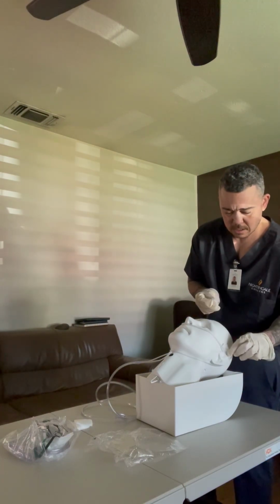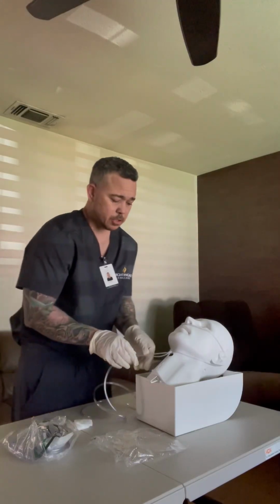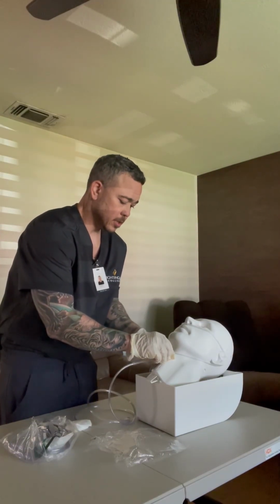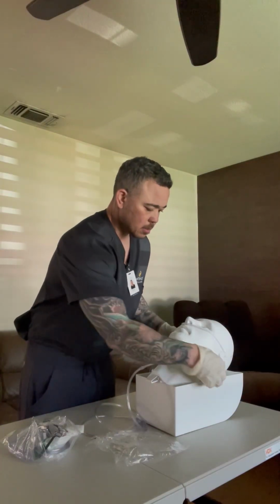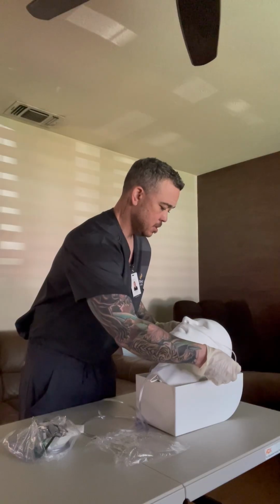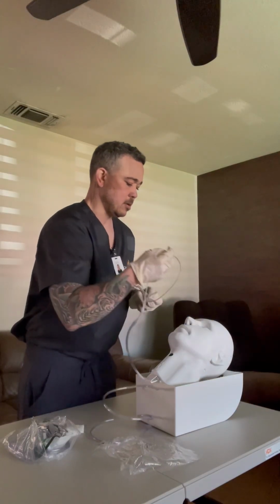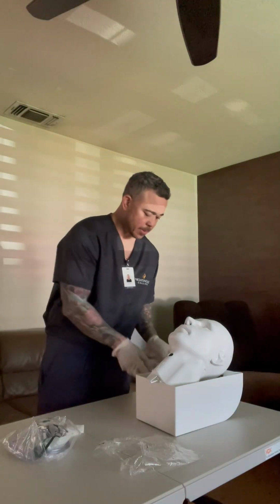Okay. And put these in the proper receptacle. The next thing I want to do is loosen up this tube here, okay? I'm going to go ahead and pull this off the ears, and remove that. Okay, sir, we got this off now, okay? This is going to go into the proper receptacle.